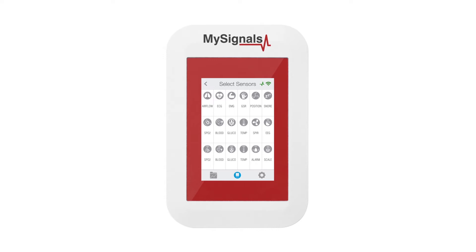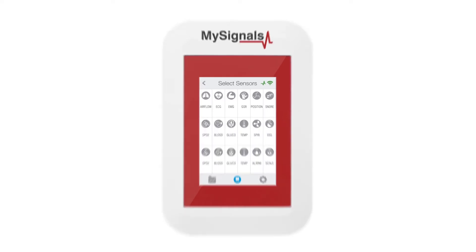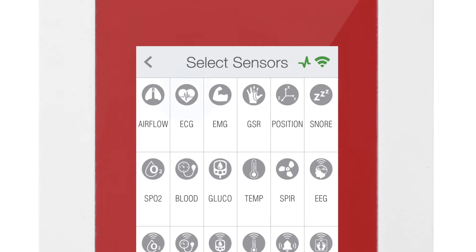In the Selection Sensor screen, you can see all the sensors available. Select the sensors you want to measure. Their icon will turn blue.